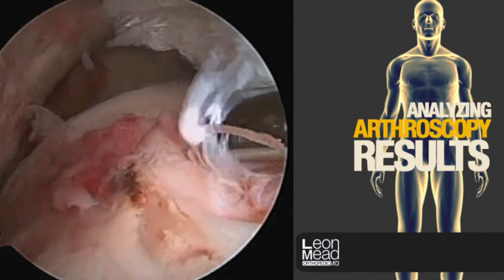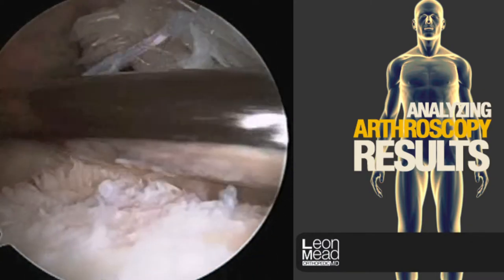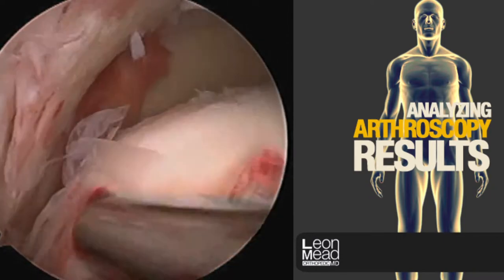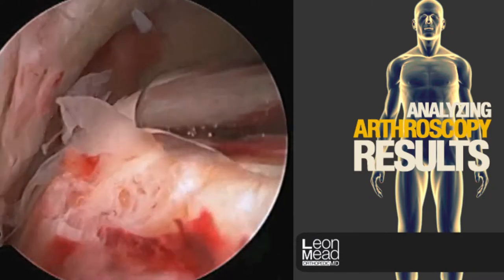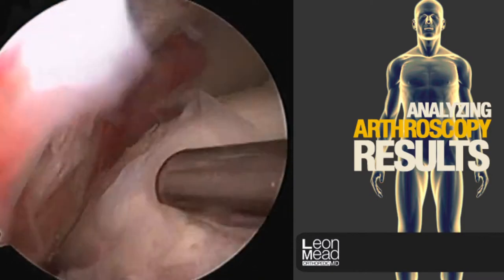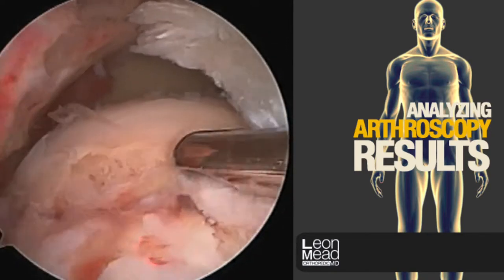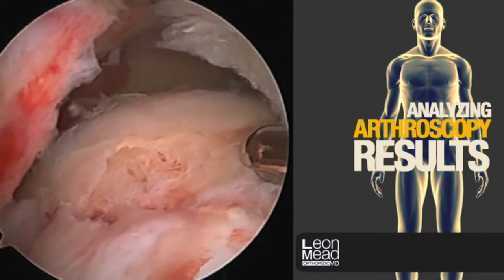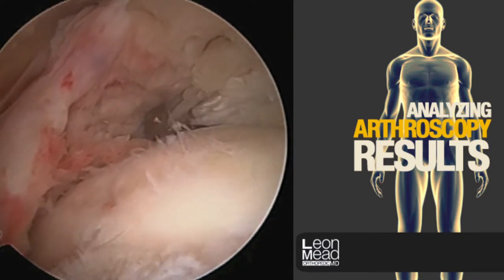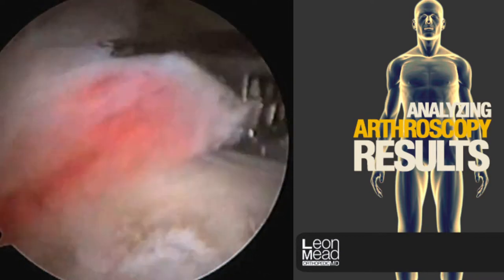The frayed material to the right is the biceps tendon, which is also quite abnormal and will be dealt with in subsequent portions of this video. The white part just to the right of the device is the joint surface of the ball — part of the ball and socket. We can see almost the entire ball here with no tissue covering it whatsoever. That's completely abnormal — the rotator cuff should completely cover that.